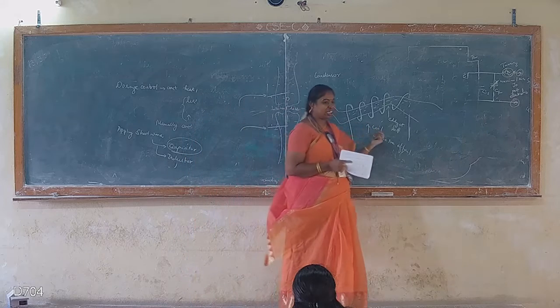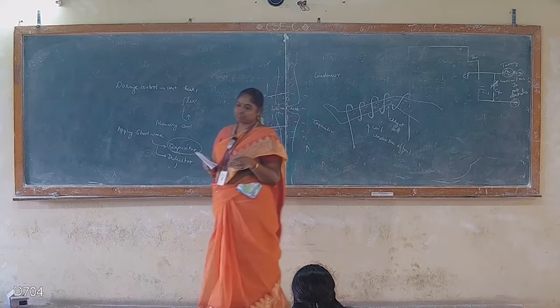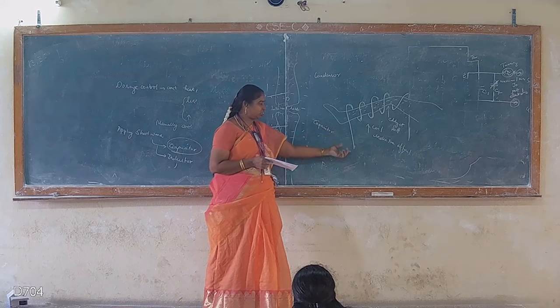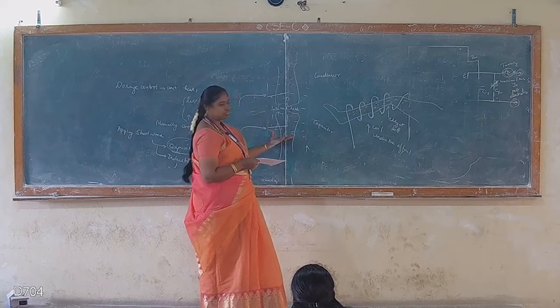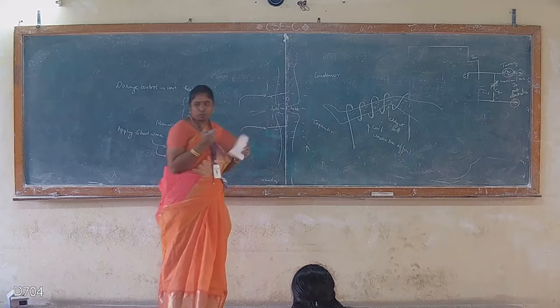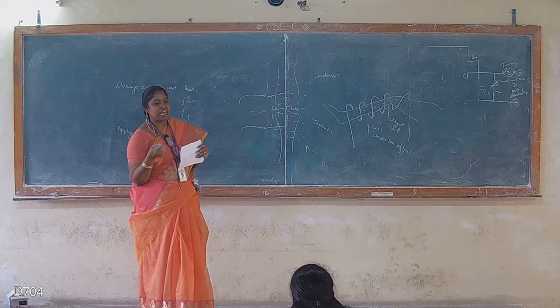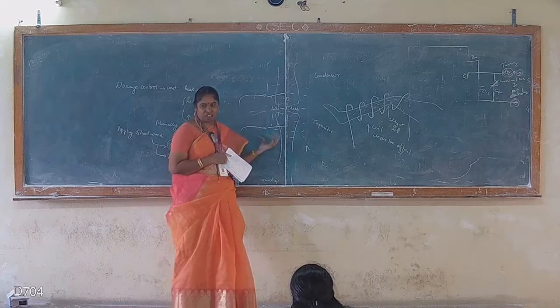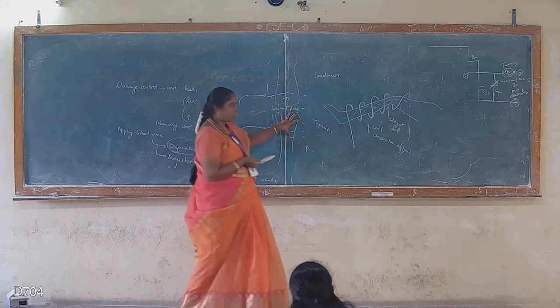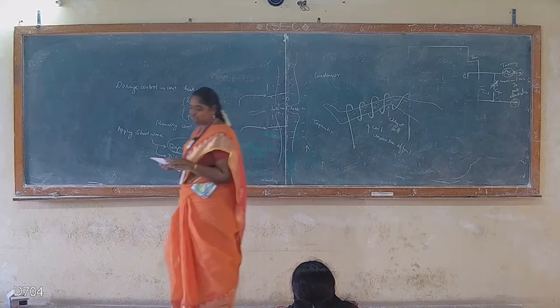Here it is due to the eddy current loss. It is applied in the form of heat to the particular subject. So in both the methods, either it is sent through the cable or by forming the two parallel plates, it cannot be done directly over the tissue or muscle. Either the tissue or muscle always should be wrapped around with some towel, and then over the towel only we are going to either form a parallel plate or otherwise send a high frequency current through a cable.